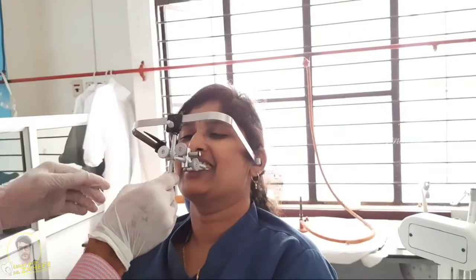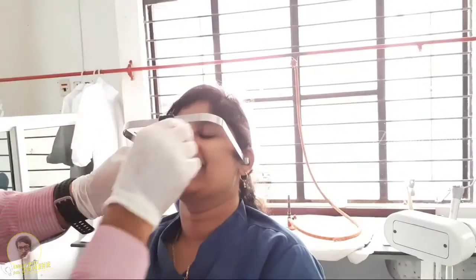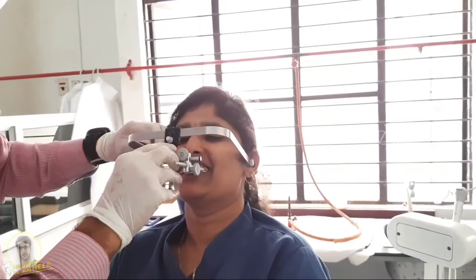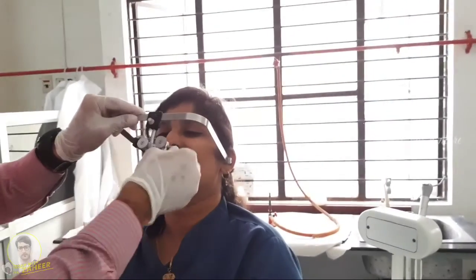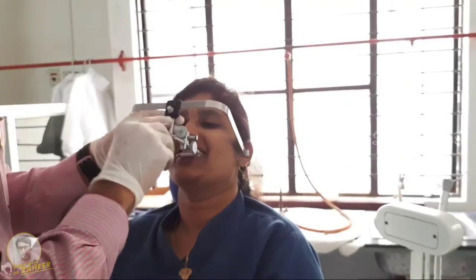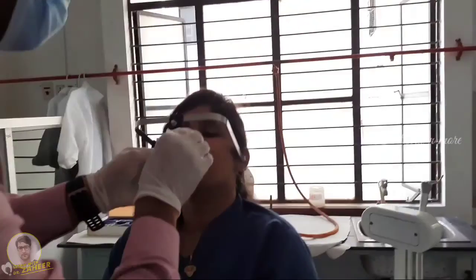All three screws are loosened. At one end the locking device is engaging the U-shaped frame — I'm tightening that portion. Now I'll be tightening all the screws — one, two, and three — according to all three planes. I am adjusting the height of the U-shaped frame so that the orbital pointer goes and sits exactly at the infraorbital notch. I'm tightening screw number one, which locks my orbital pointer at the infraorbital notch.